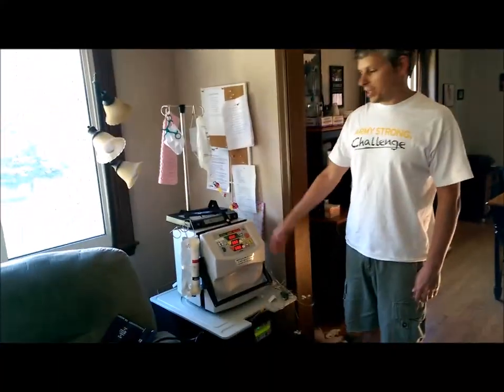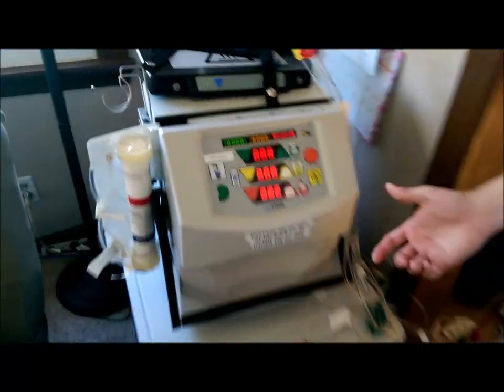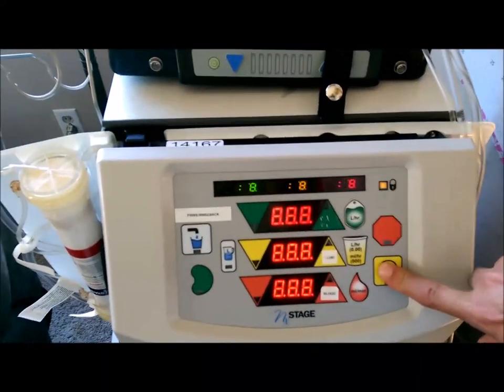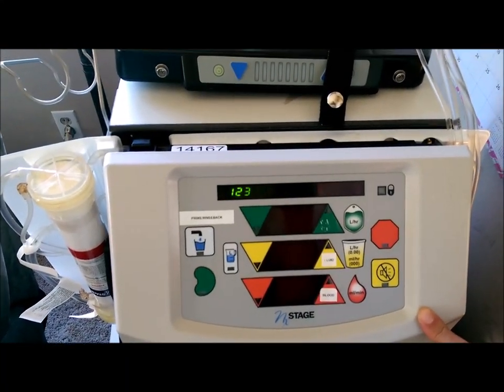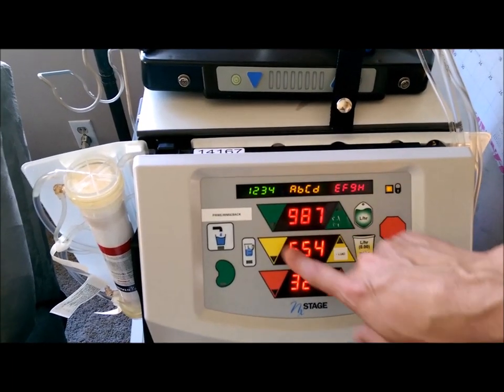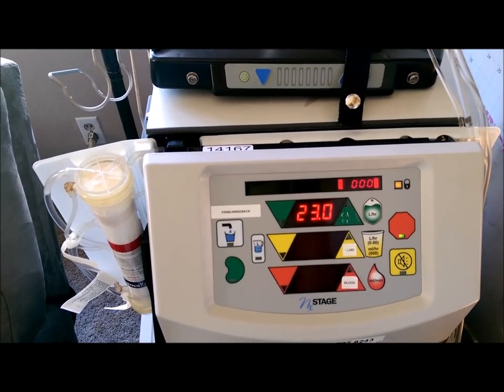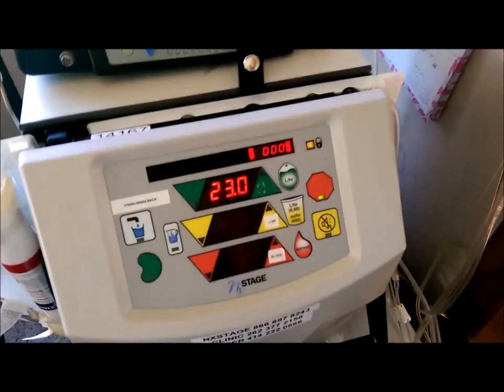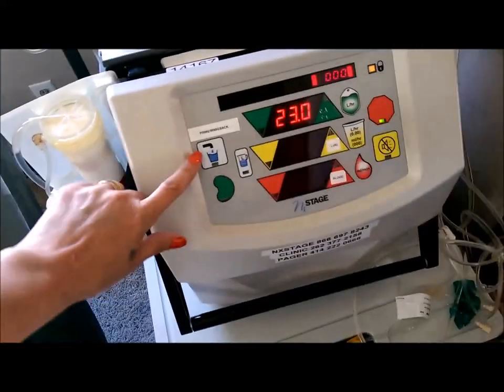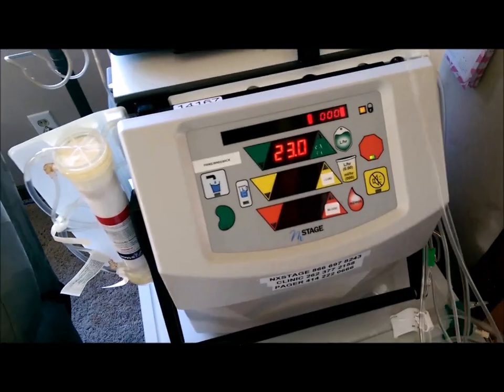It's been 15 minutes and the machine is beeping at us — it's got eights on all the displays, which means it's ready to go. I press the mute button, the display changes and counts down. Now we're ready for the part they call 'snap and tap,' which means we have to get all these air bubbles out of the lines so they don't go into Tammy's blood.